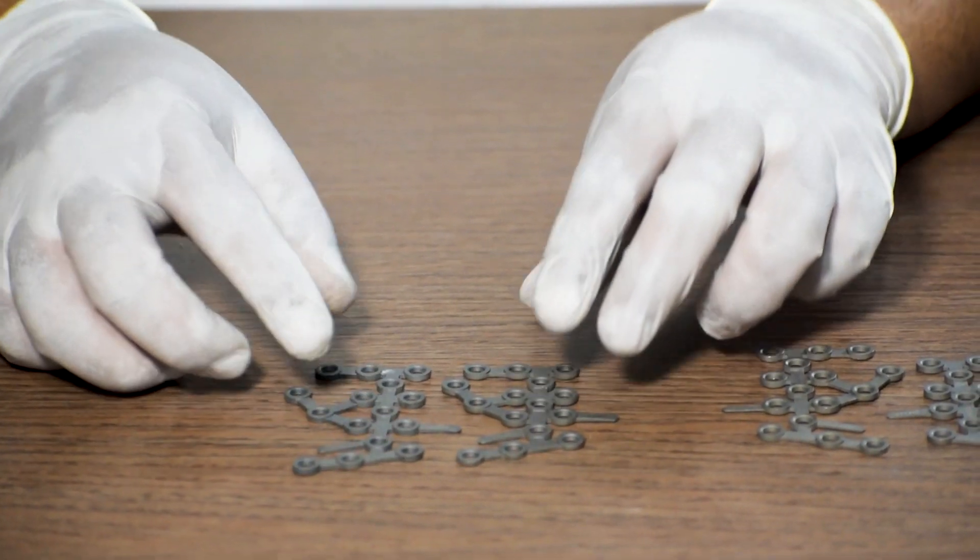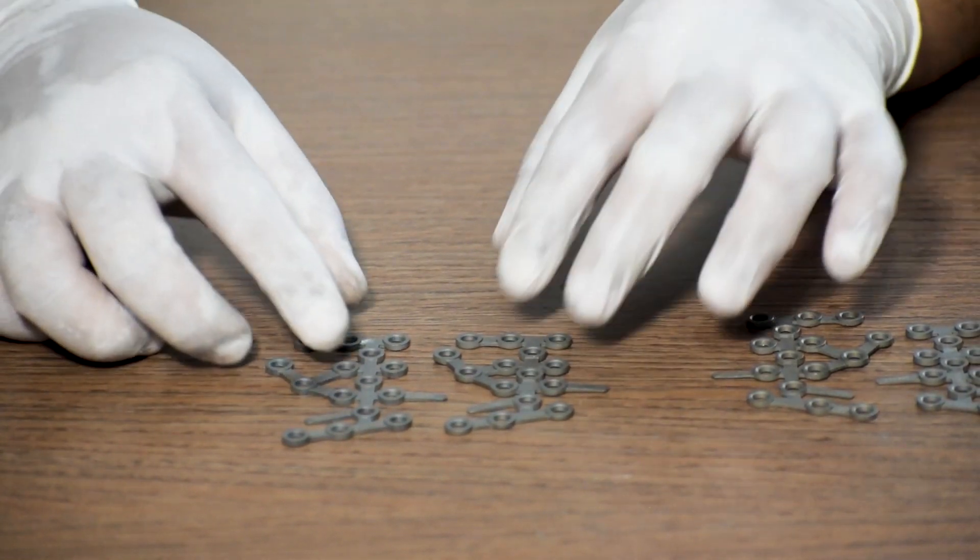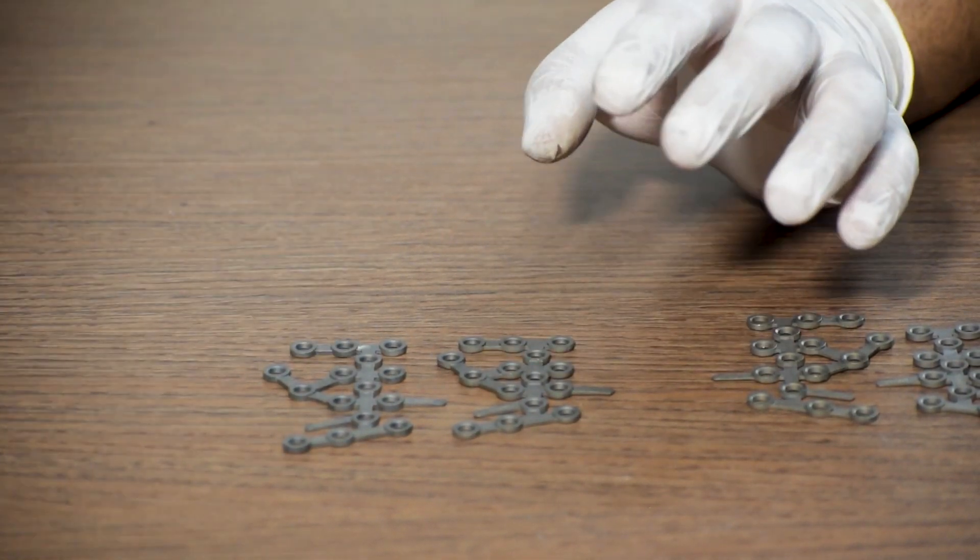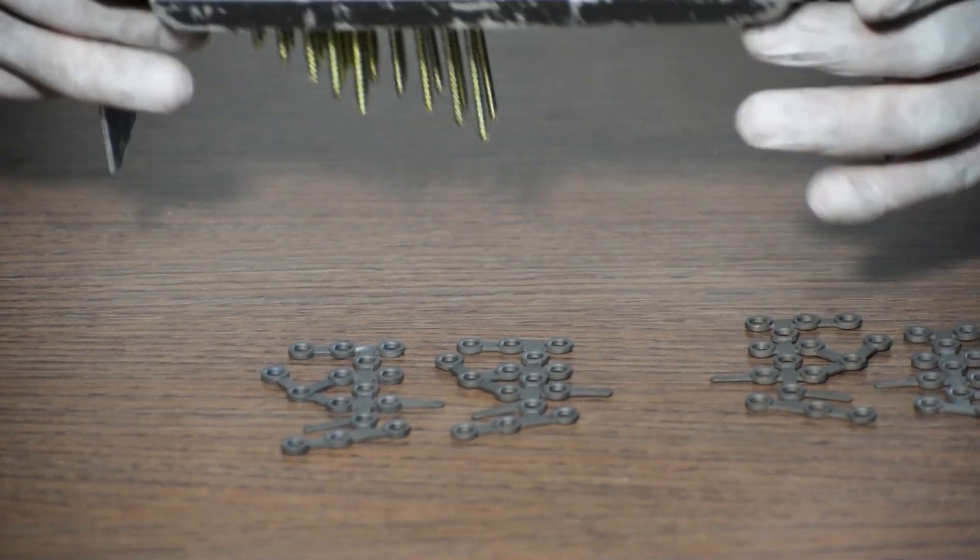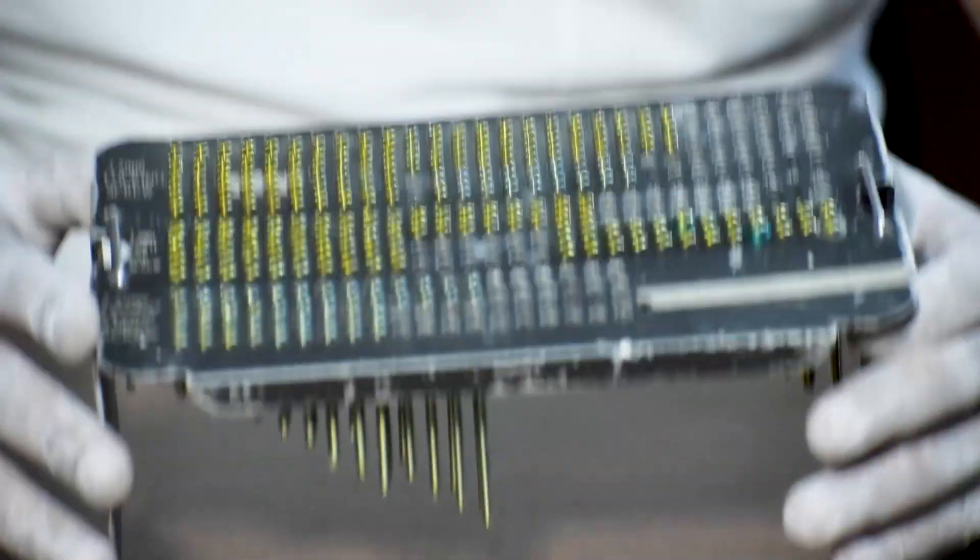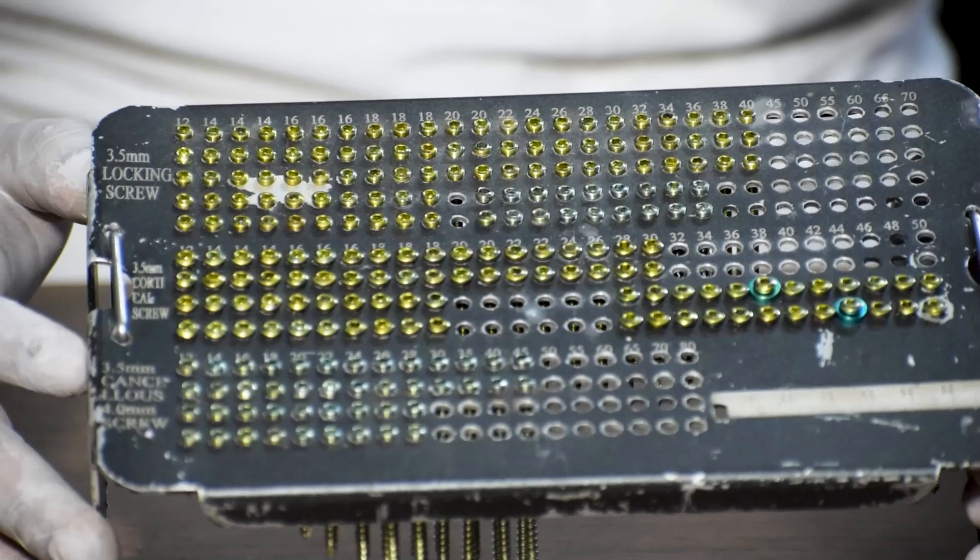Calcaneal plate is a 3.5 system. We can fix this plate with a locking cortical, locking cancellous, non-locking cortical or with non-locking cancellous screws.